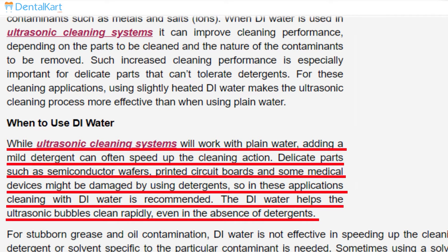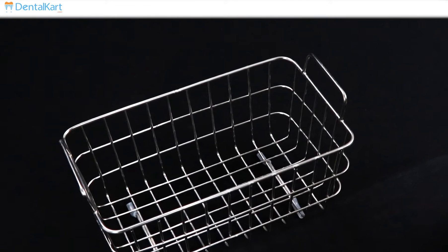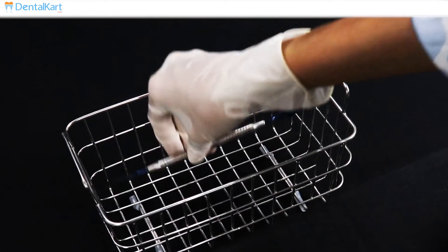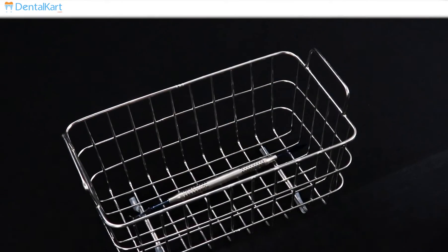Then place the loose instruments in the stainless steel basket.